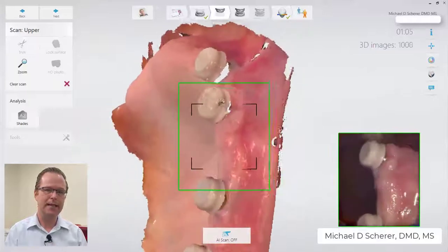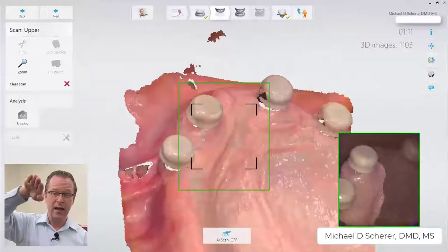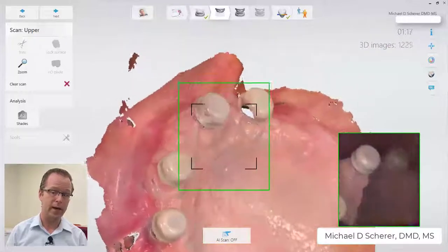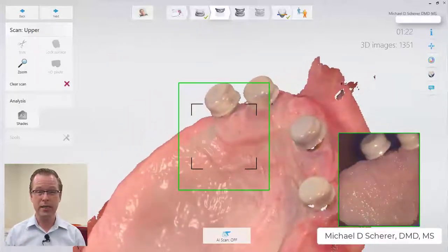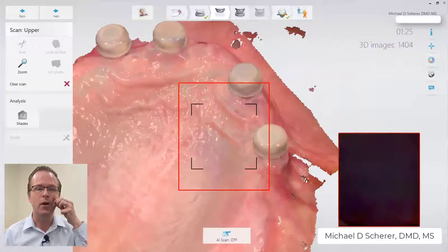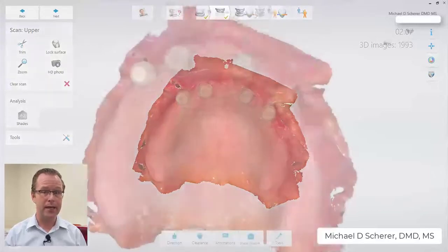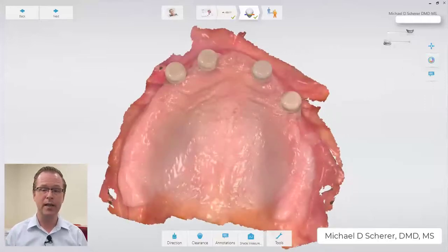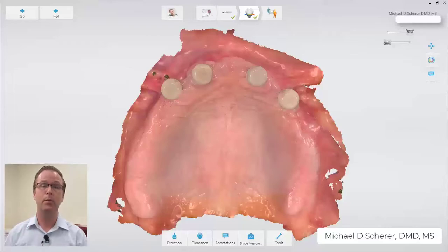I go back and fill in details around the locator scan body, being cautious not to scan too much of the vestibular area flat. I lean the scanner as much as possible into the geometry around the locator scan bodies to capture that geometry without picking up additional soft tissue changes, since most intraoral scanners get lost when the cheeks move a lot. Keeping vestibular areas stable, we ultimately get a very nice, clean scan that we can send to our laboratory to make a very predictable digital or digitally produced analog denture.